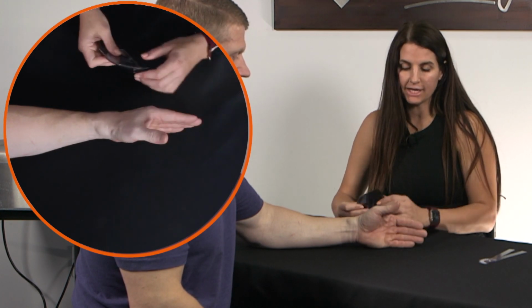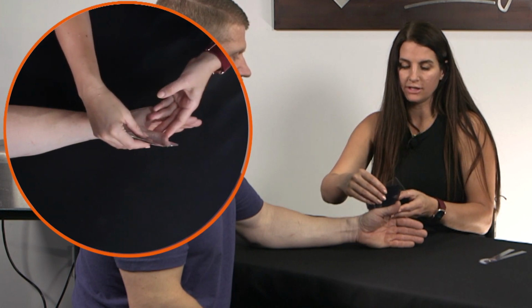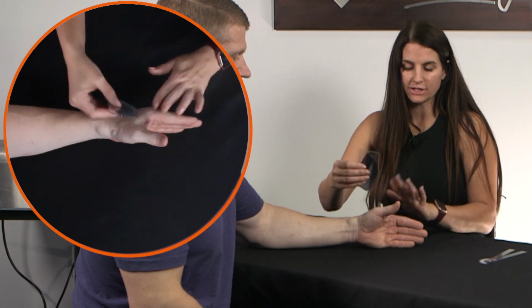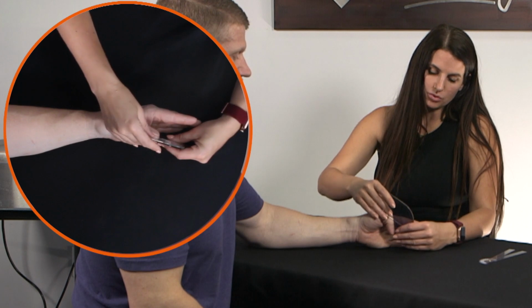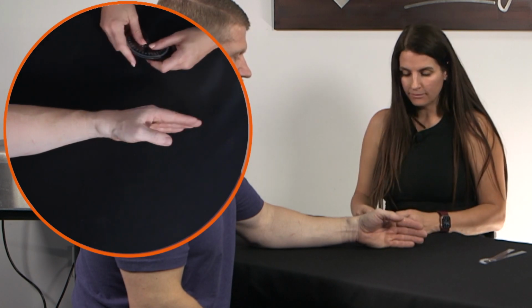Now the IP, he has hyperextension. So you can notate the hyperextension by using this goniometer, and he has 28 degrees of hyperextension. Now go ahead and flex. And then you lay the goniometer right on top over the joint, and he has 55 degrees flexion.